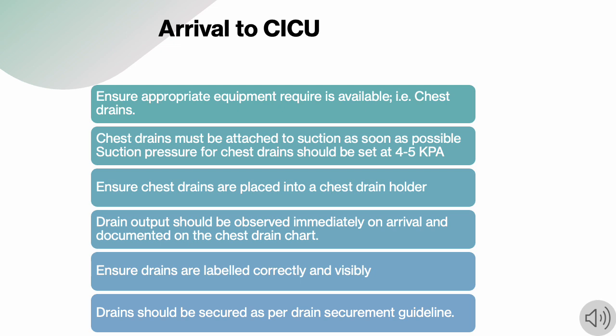On arrival, it is also vital that drain output is documented as soon as possible. We will discuss how to document chest drain losses later in the presentation, but it's important to have an awareness of how much is present on arrival in order to be able to acknowledge any significant drainage post-patient transfer.